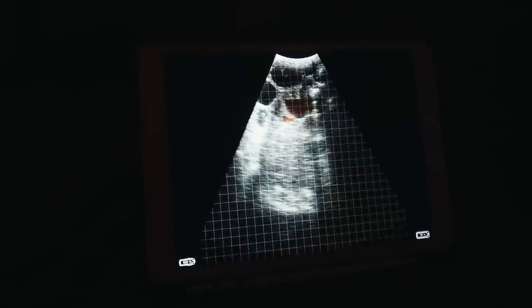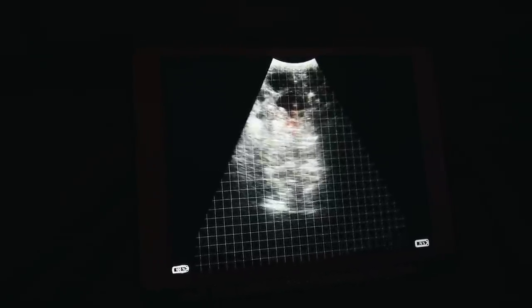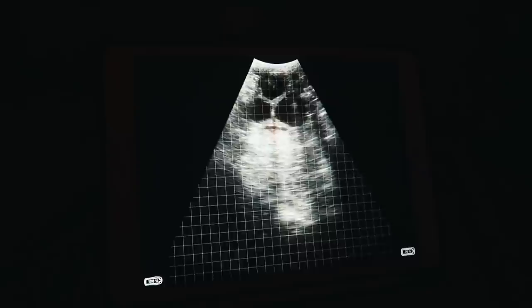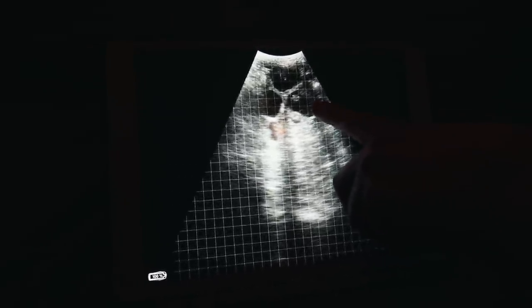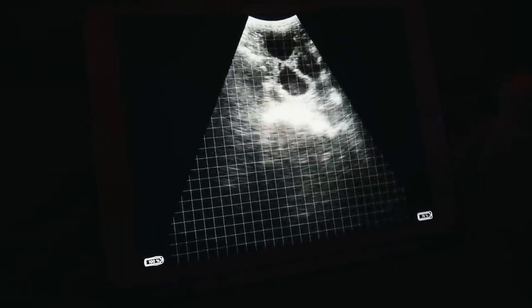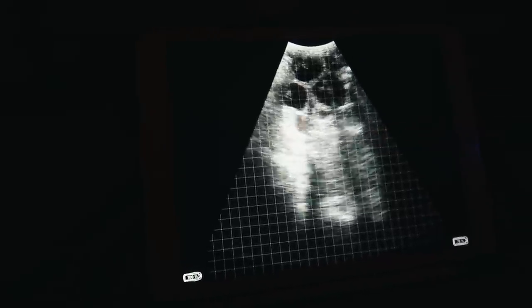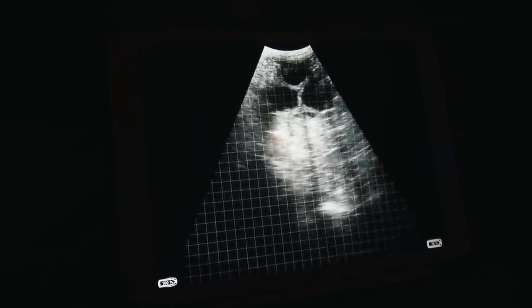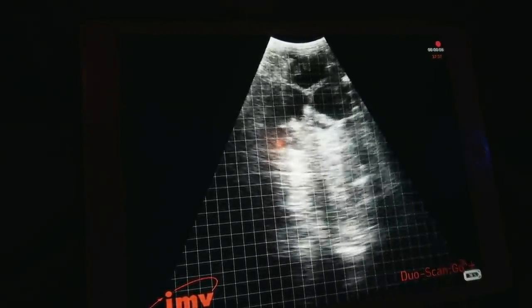Oh, she's bred. Look at how many. Ooh, definitely nice. Two right off the bat. Three. All right, so I definitely see like three. I can see them really good. And maybe one at the bottom there, you see? Four. Wow, good job, girl. So I see three really, really good ones in there.